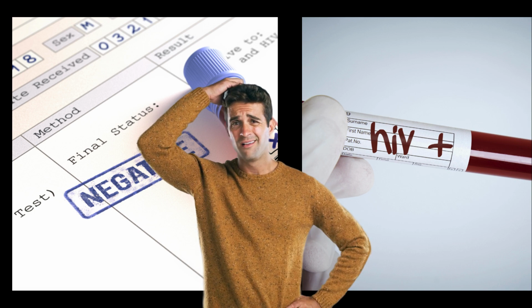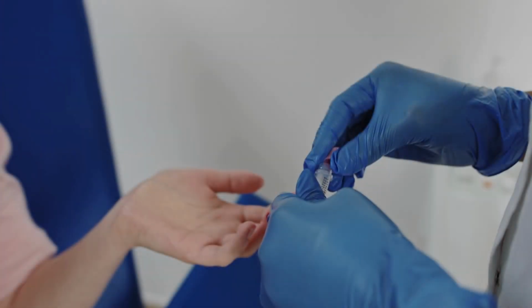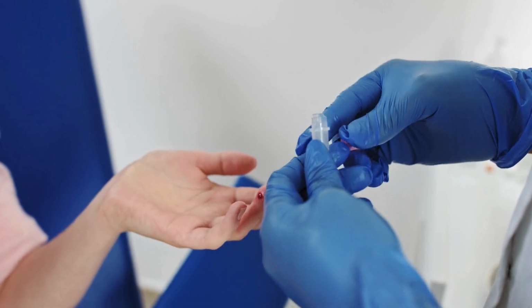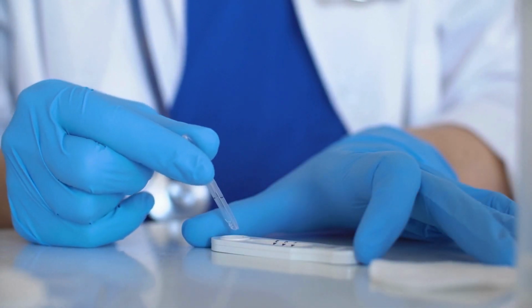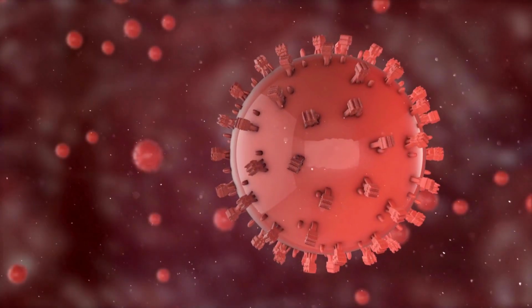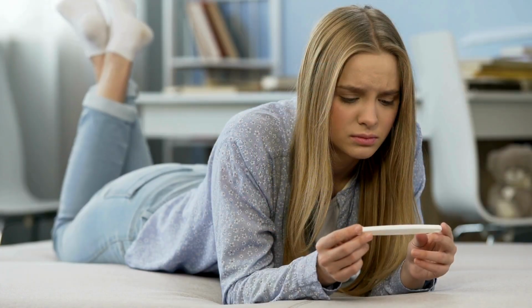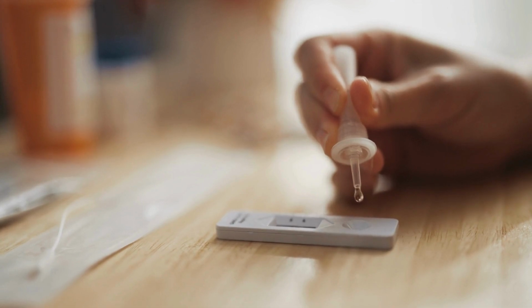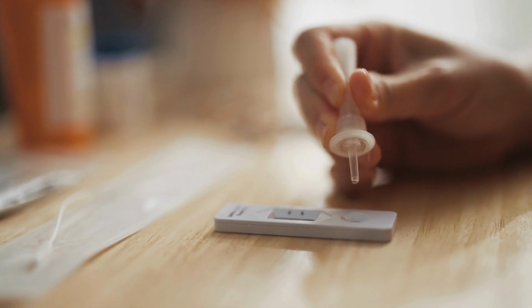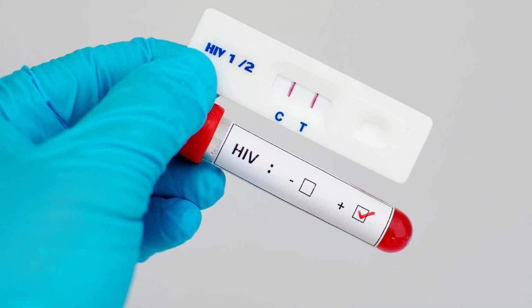HIV test strips, also known as rapid HIV tests or lateral flow immunoassays, are simple-to-use diagnostic tools designed to detect the presence of HIV antibodies in a person's blood, saliva, or urine. These tests provide quick results, usually within 15-30 minutes, making them valuable for both clinical and home use settings. Here's an overview of how HIV test strips work.